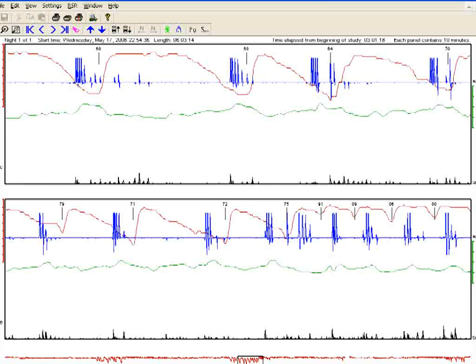That's true. And when you see the screen here, this is showing the raw signals. Most all of them will generate a report that's automatically scored, and it'll say the AHI is XYZ, the LSAT's this. So you can look at the raw data here, but don't let this scare you, because with a little bit of training and a click of a few buttons, it'll score the test for you automatically and give you a decent idea of what the patient's AHI and all the other numbers that I see.